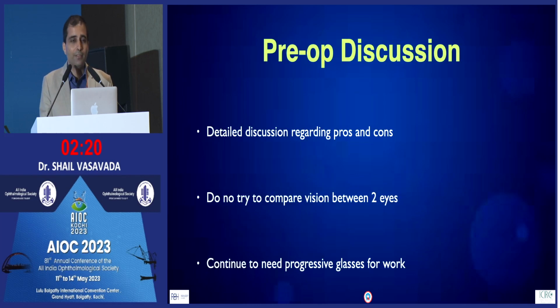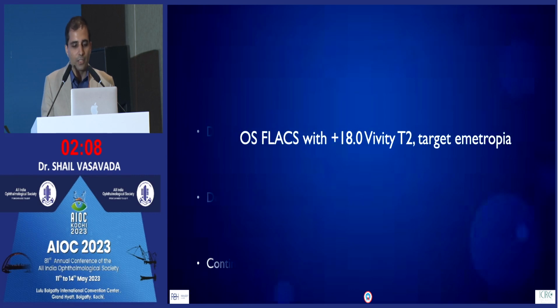So once again, we discussed the pros and cons, that you have a monofocal in one eye. We feel this should work binocularly quite well. Do not compare the vision between the two eyes, and you'll still need glasses, particularly for near work.